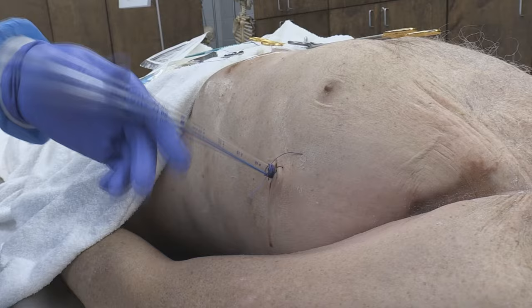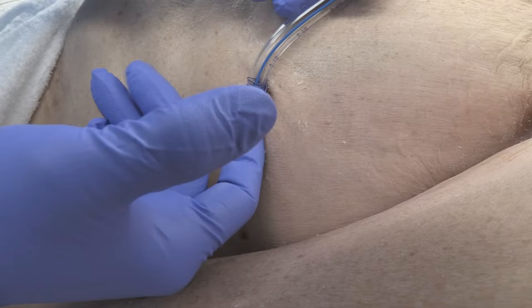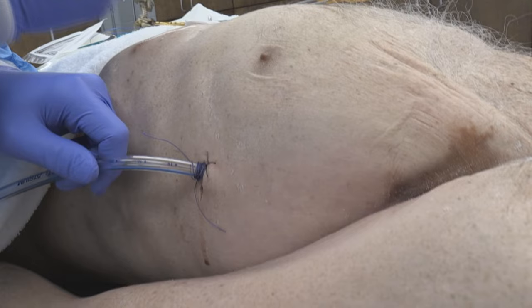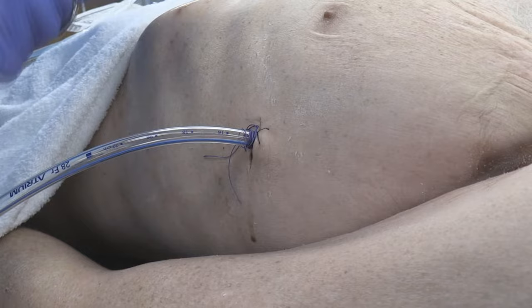So it's a very simple tie. I've just left a little bit of laxity there, but it's really only one tie in the middle of the thread, and then I loop it around, put a mosquito in underneath, and just loop it through the lower portion. That's just pulled through, and then the tube is secured at the base.